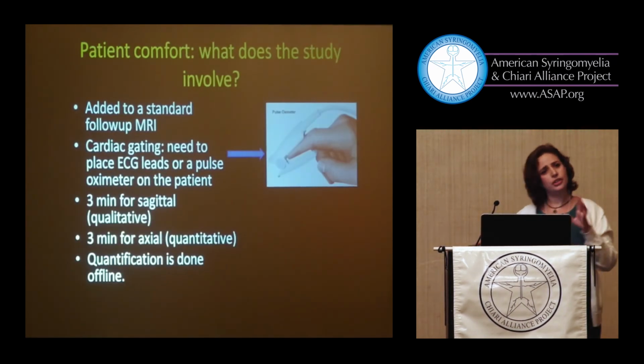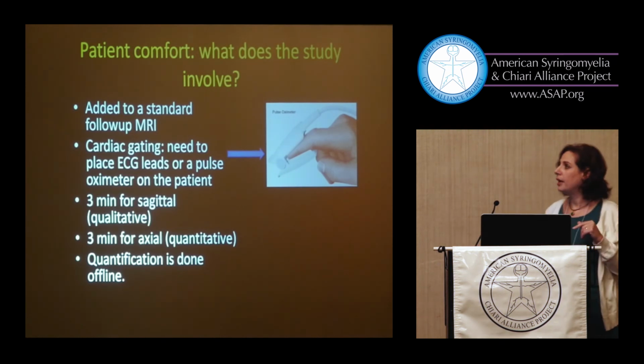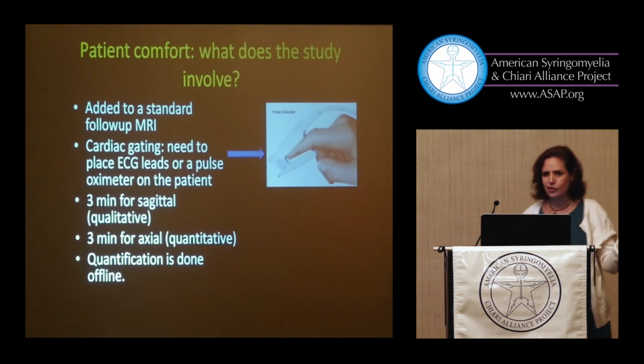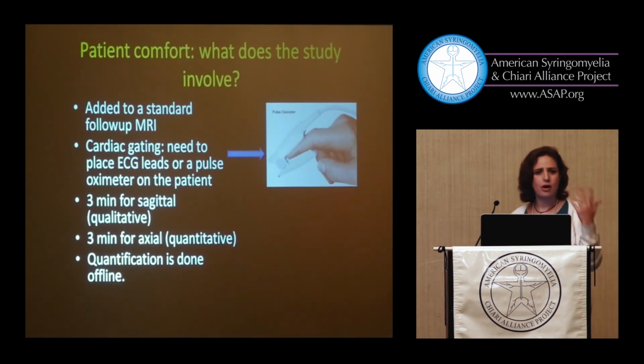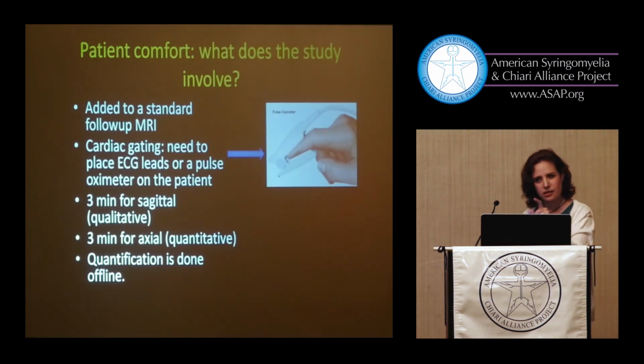In terms of comfort, just so you know, though some of you may have had these, how many of you have had any of these studies? Has anyone? One, two, yeah, okay, that's not bad. That's really not bad. It's just added to your follow-up MRI. If you're getting regular MRIs, you're just going to lie there a little longer. We have to use cardiac gating. Remember how small that signal was?